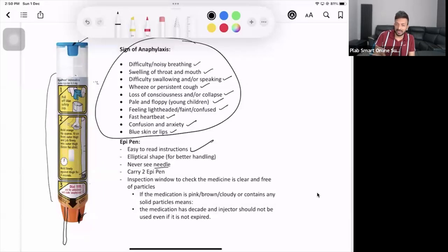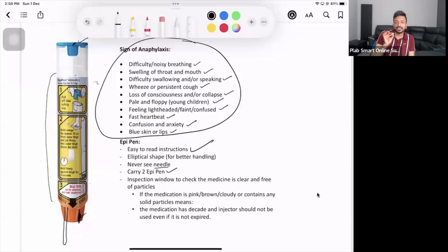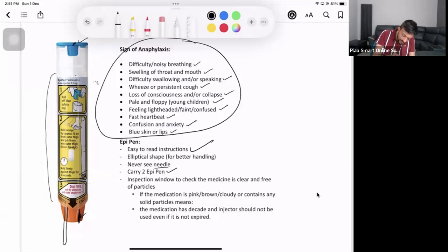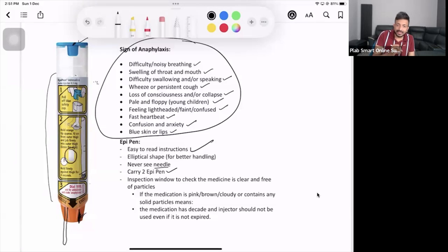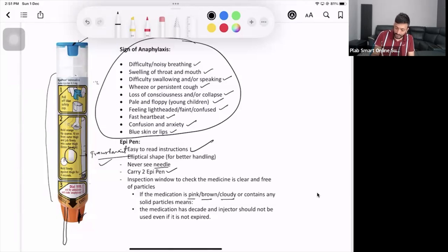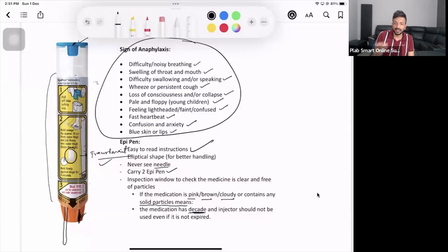You always carry two EpiPens. Why? I'll tell you now. Before you use any medication you need to check the expiry date, so please check the expiry date. You need to check another thing as well: the clear window. This is your clear window. This white color, in the real EpiPen you will see this is actually transparent. If it is transparent, good to use. But if it has changed its color, if it has become pink, brown, cloudy, or contains any solid particles, it means the medication has decayed and please don't use it even if it is not expired.